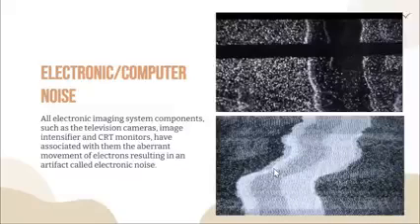So it is inherent; some of it is inherent to monitors. Like quantum mottle, electronic noise is also a random effect that produces regions of increased image brightness that appear on image displays such as flashes of light or snow.